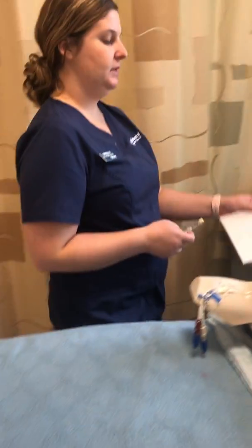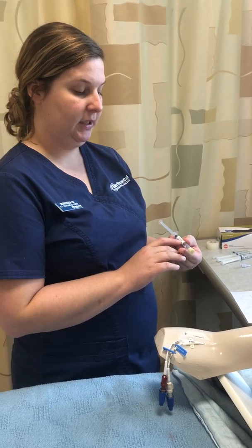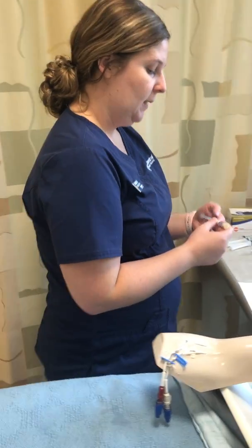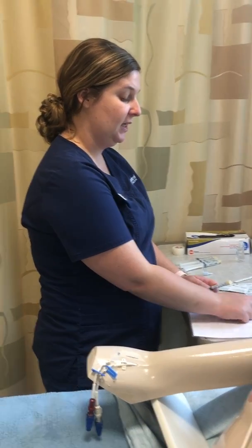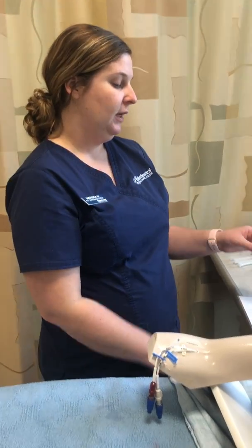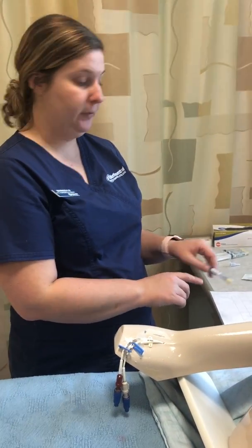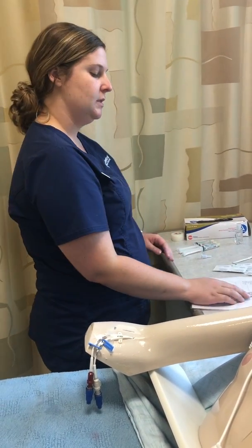So I'm going to go ahead and gather my supplies. The first supply is the lorazepam itself, and I can check and see that the expiration date is 12/20/30, so it is not expired, and that I'm going to be giving it for Ron Smith every 4 hours for anxiety, and it is okay to give. He has allergies to morphine that I know, and so it is okay to go ahead and give the lorazepam. I'll get dose accurate in a minute with this.